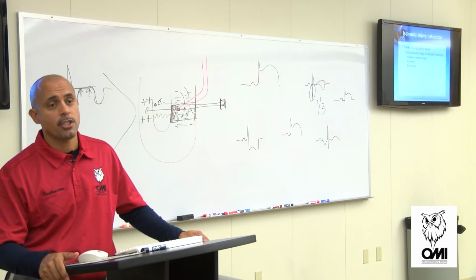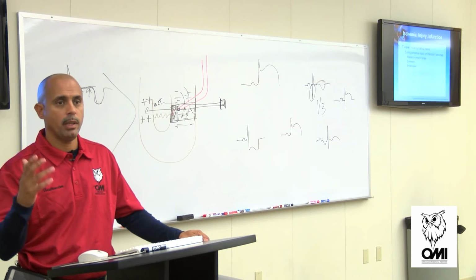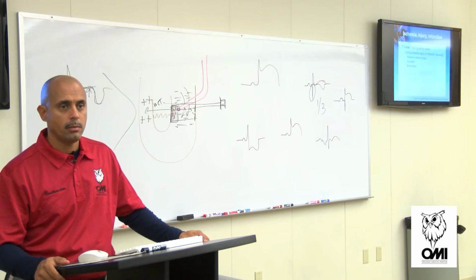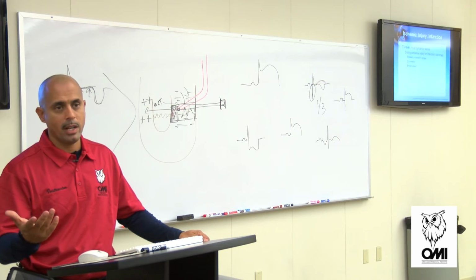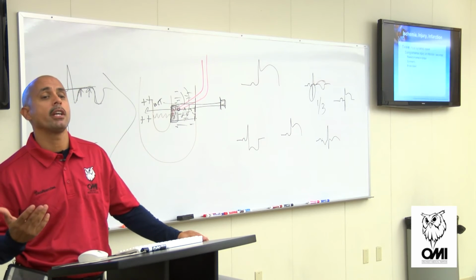Now, if it's just depression, all you see is depression, and I call it a cardiac. I got a cardiac patient, medical yellow, medical red. I can't call it a STEMI? No. What does STEMI stand for? ST elevation myocardial infarction. There's no elevation. Why? It's not transmural yet. But he'll be treated. And what hospital would you take him to?